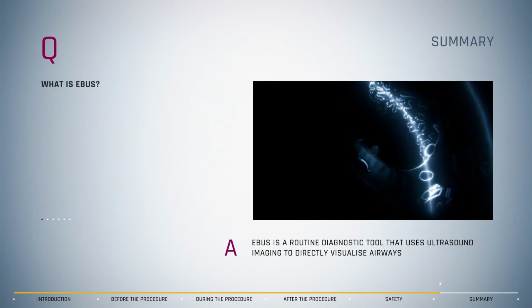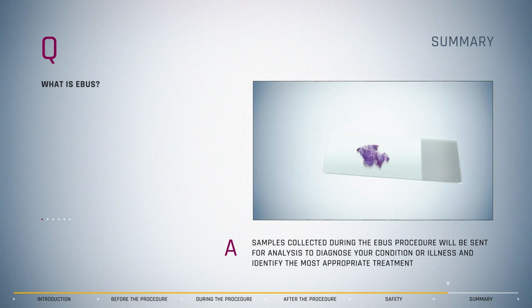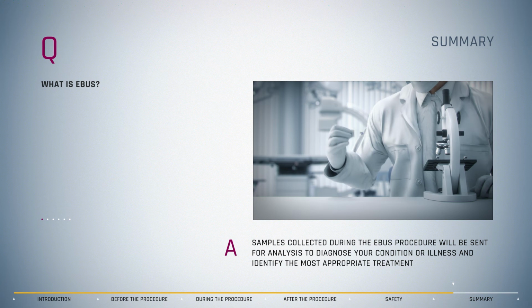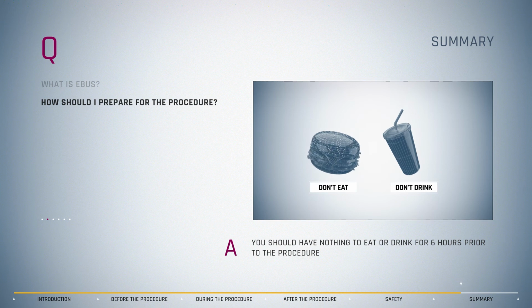EBUS is a routine diagnostic tool that uses ultrasound imaging to directly visualize airways. Samples collected during the EBUS procedure will be sent for analysis to diagnose your condition or illness and identify the most appropriate treatment. You should have nothing to eat or drink for 6 hours prior to the procedure.